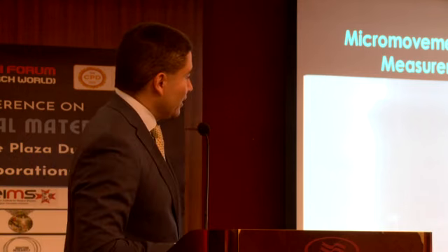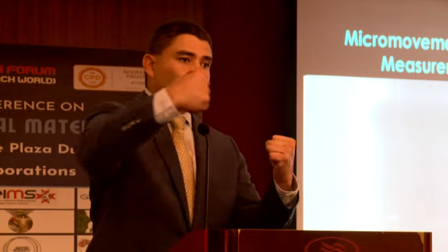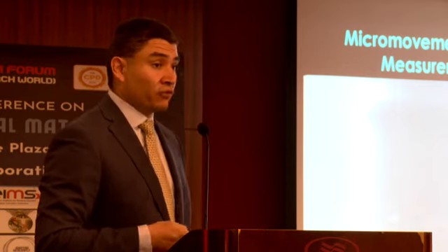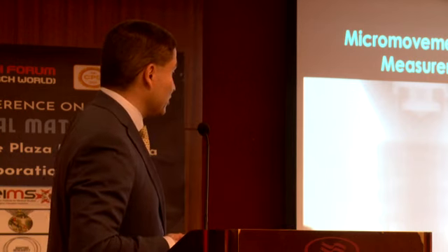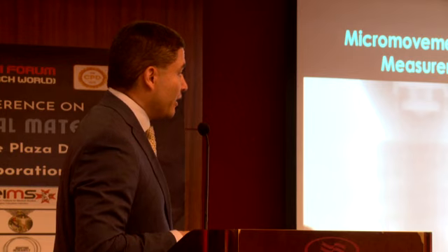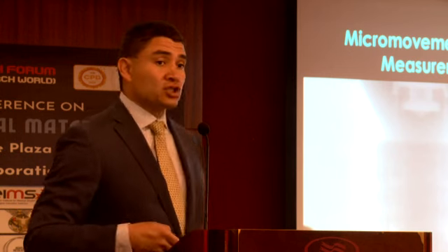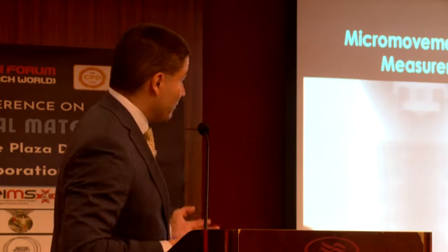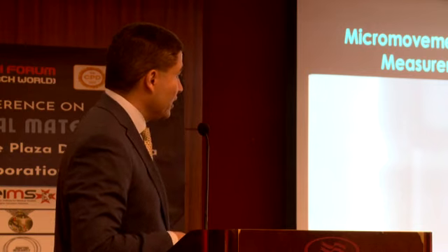Okay. What I will tell you will happen if the movie plays is that in these particular implants, there is a gap that forms when the forces of occlusion hit. And that gap is actually detrimental for bone loss. The same thing is going to happen in other implants, but implants like, for example, the bone level Straumann have a more taper connection here. So the micro gap and micro movement is not going to be as much as in other implant systems, right? Same for the Astra system, also more taper effect here that prevents the micro movement from happening.